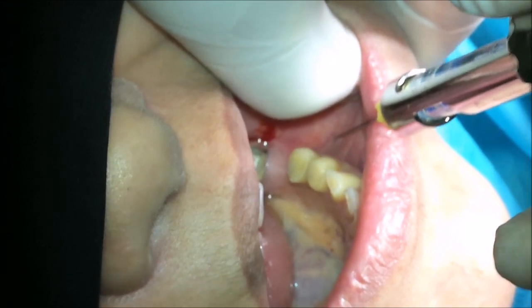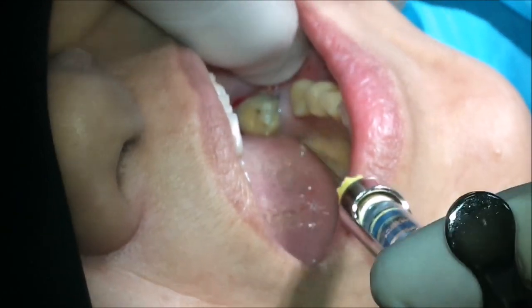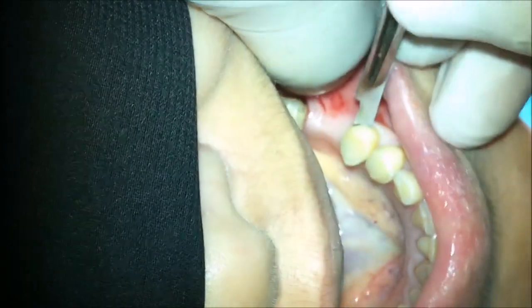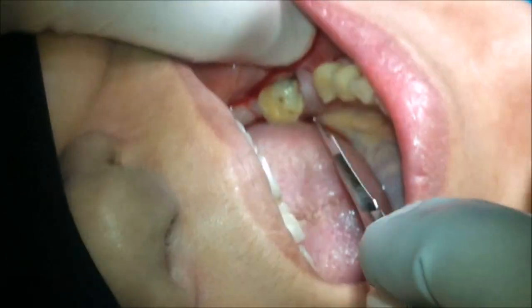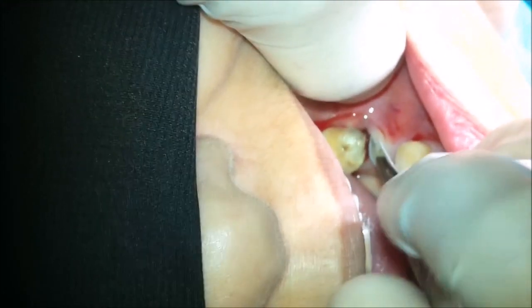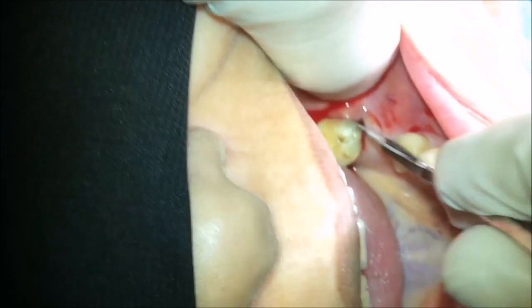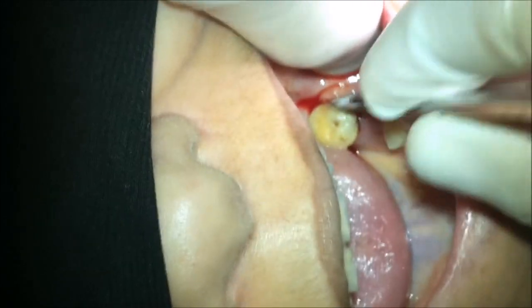I prefer to use the infiltration anesthesia in such a condition to be sure that you are away from the inferior alveolar canal. With the infiltration anesthesia, if you are close to the canal, the patient will feel pain and you can stop. You can put a guiding pin and make a periapical X-ray to be sure.